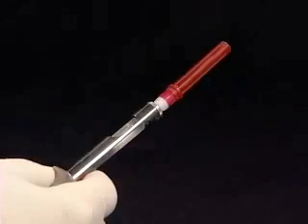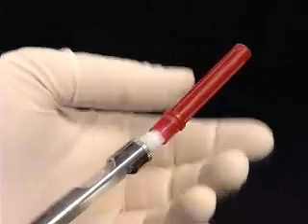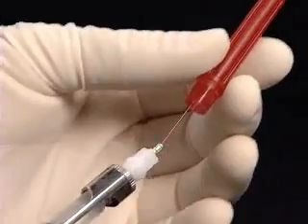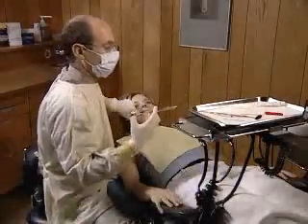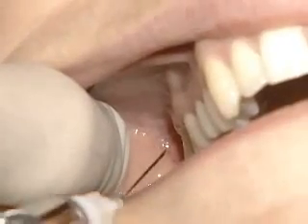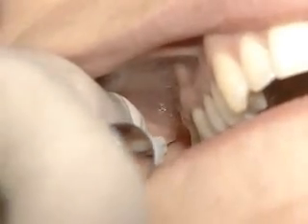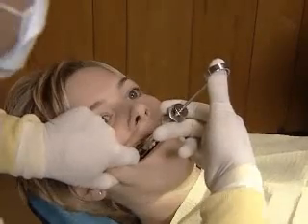To bend a needle, what you need to do initially is to loosen the cap, and then using the cap in a sterile manner, give it one bend and one bend only, removing the cap to determine the final degree of bend. And with the jaw closed, the teeth together, the syringe inserts into the insertion point against the posterior mucosa. Once it's advanced in, the angle is corrected. The needle is advanced back posteriorly 25 millimeters.